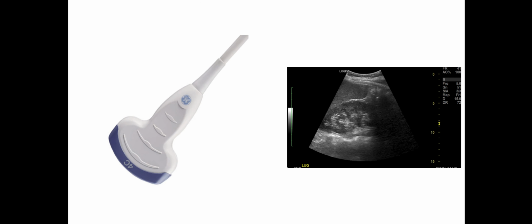Imaging planes. Within CT imaging, you'll be familiar with sagittal, coronal and axial planes. But in ultrasound, whilst we talk a little bit about it, by convention we would use the transducer marker to orientate ourselves. When you look at the transducer, typically on one side there'll be a bump or a ridge or something that creates a marker that you can equate to. And what this marker equates to is this part of the screen. So if this transducer was looking in this way, the marker will be the upper side.